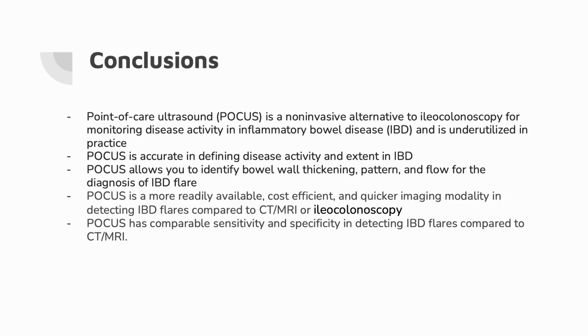Conclusions. POCUS is a non-invasive alternative to ileocolonoscopy for monitoring disease activity in IBD, and it's underutilized in practice, at least in the United States. POCUS is accurate in defining disease activity and extent in IBD. POCUS allows you to identify bowel wall thickening, pattern, and flow for the diagnosis of an IBD flare. POCUS is a more readily available, cost-efficient, and quicker imaging modality in detecting IBD flares compared to CT, MRI, or ileocolonoscopy. POCUS has comparable sensitivity and specificity in detecting IBD flares compared to CT, MRI.